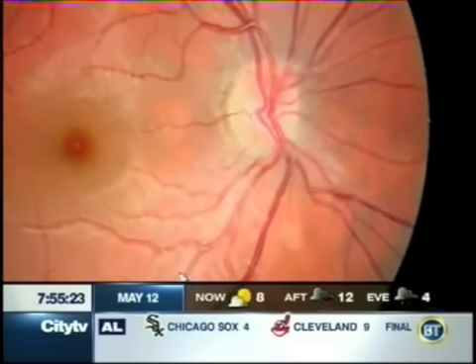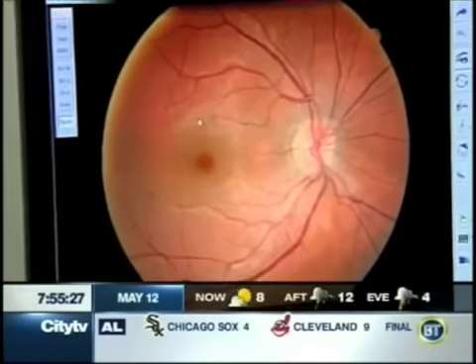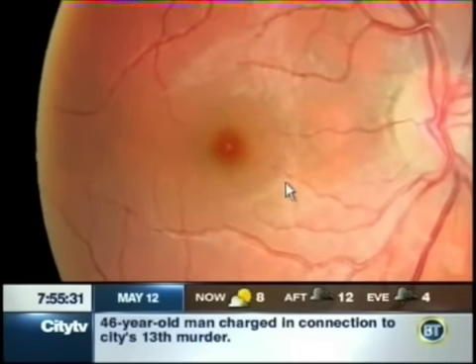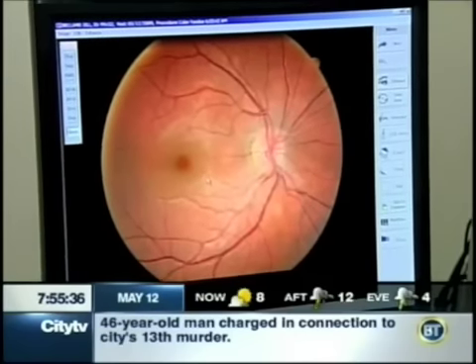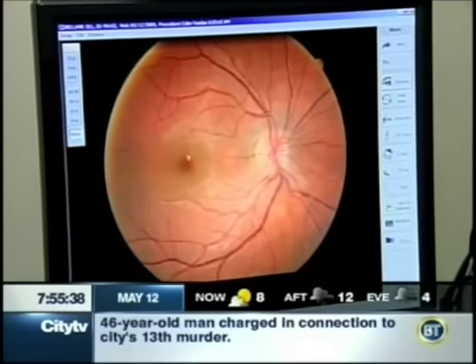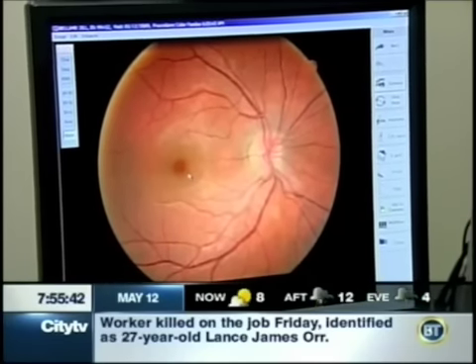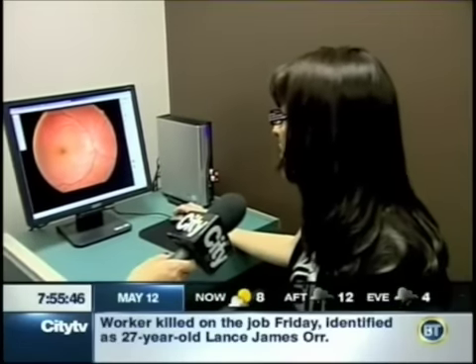Everything's very healthy in the blood vessel pattern here. What about this cloudy bit? And the little whitish look here is actually a very healthy view. It's reflections off of your wet, young retina, so that's normal. And then this little red dark spot, it's darker because there's more nutrition, more blood flow behind the area called the macula, and that's where all the cones are concentrated, and that's where all your detail vision is.